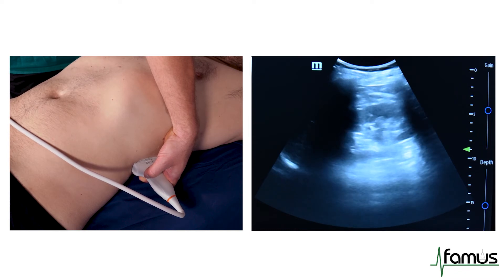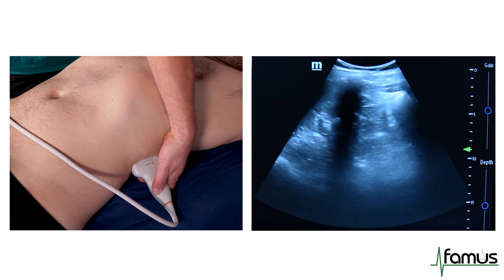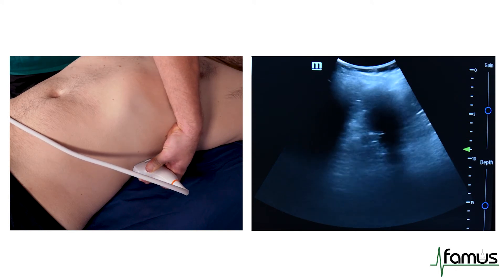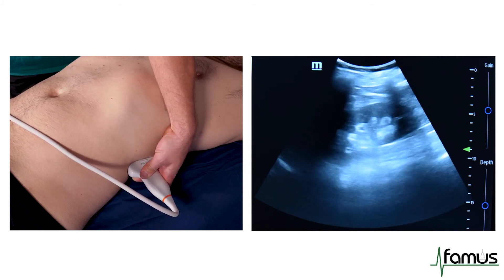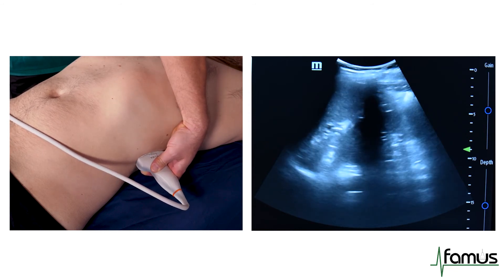We then again tilt our probe until the kidney is just disappearing and slowly examine the kidney by tilting our probe back. Finally, we will look for free fluid in between the spleen and the kidney.